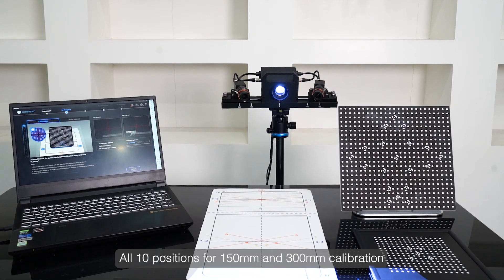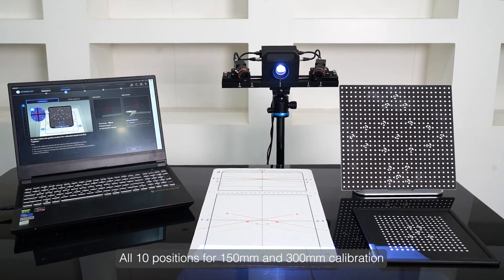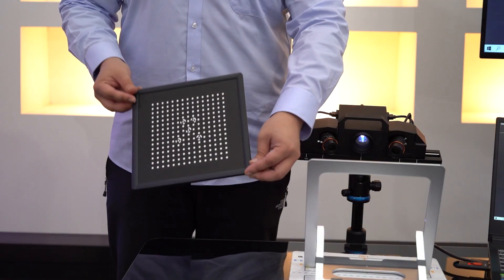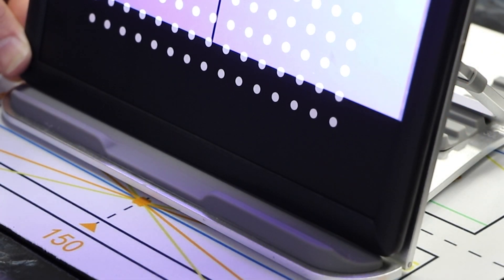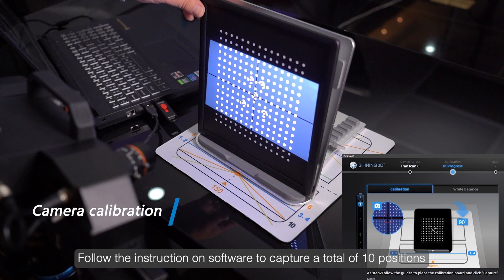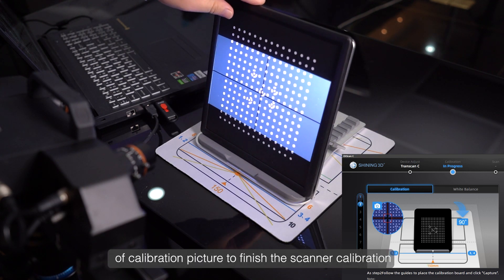All 10 positions for 150mm and 300mm calibration are marked on the calibration pad. Please maintain the scanner and calibration board position as in the adjusting step. Follow the instructions on the software to capture a total of 10 positions of calibration pictures to finish the scanner calibration.